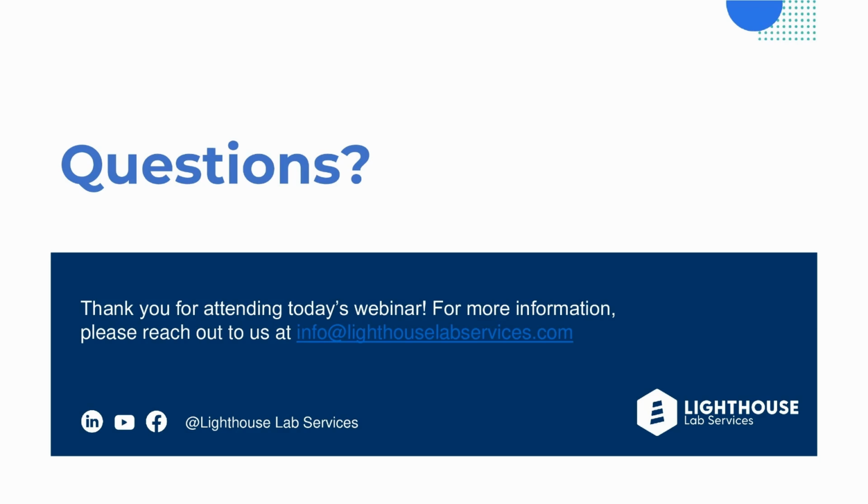Mikroscan's Z scanning compared to others that use Z stacking. That seems like it would be one that Jason, you or Dr. Velasek would probably be best equipped to answer. Yeah, I'll take a first shot at it, then maybe Mark can speak from his experience. When we're in live mode, it's not a scan, it's just a live streaming image. So the wheel on your mouse is your focus, just like the focus on a microscope. So you really have free rein of going up and down in the Z plane throughout the specimen.